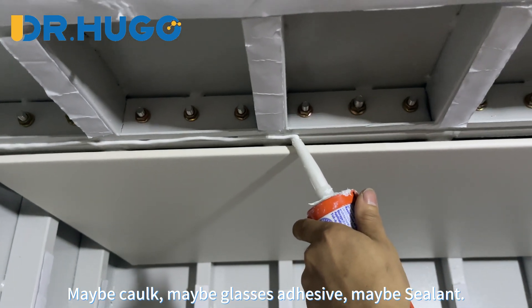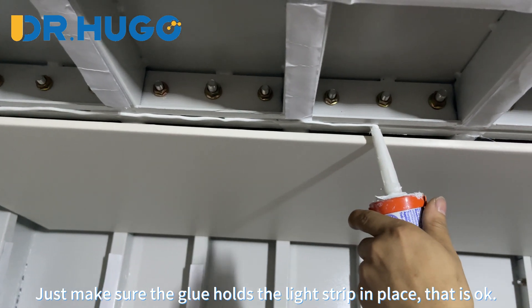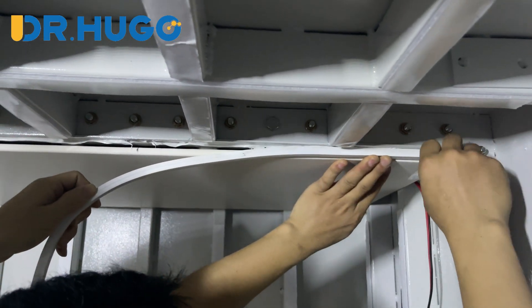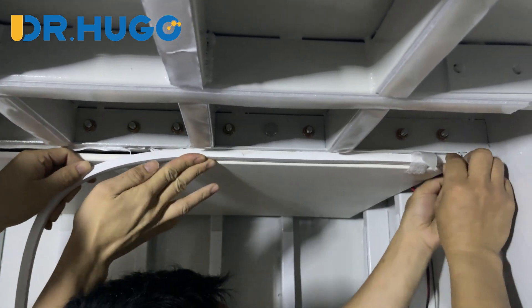We are not sure what you call the glue — maybe caulk, maybe glass adhesive, maybe sealant. Just make sure the glue holds the light strip in place. We can tape the light strips before the glue does its job to hold the light strip in place.